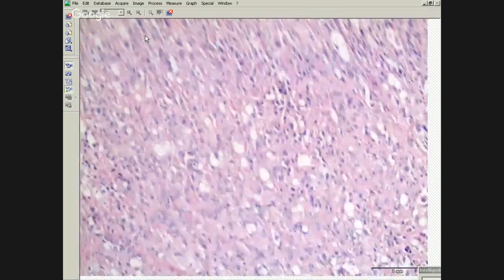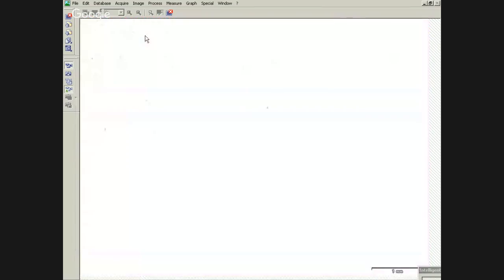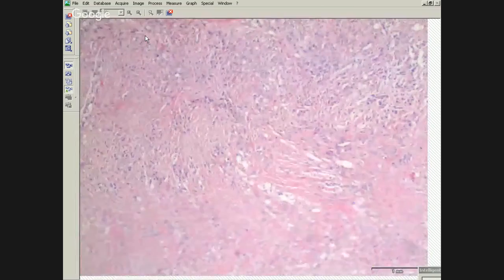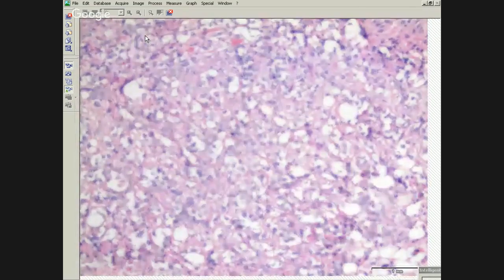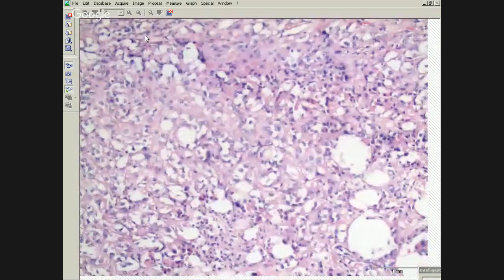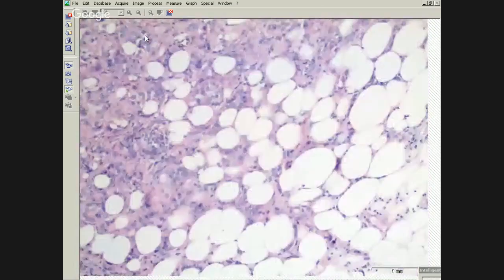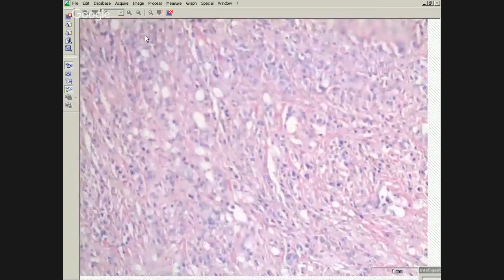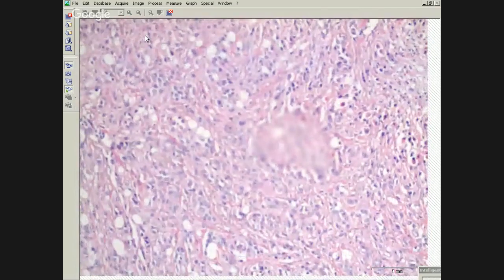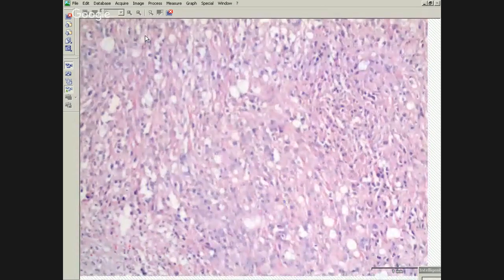Okay. So that's good. So you have an infiltrating tumor. Usually these will have kind of a myxoid or myxochondroid background. We're not seeing that quite as well here. But the cells have this very vacuolated, almost signet ring type look to them. If you look around, usually you can find some red cells in the lumen of these. We won't waste time looking for that, but you can sometimes see those. So you've got another epithelioid tumor of the pleura.